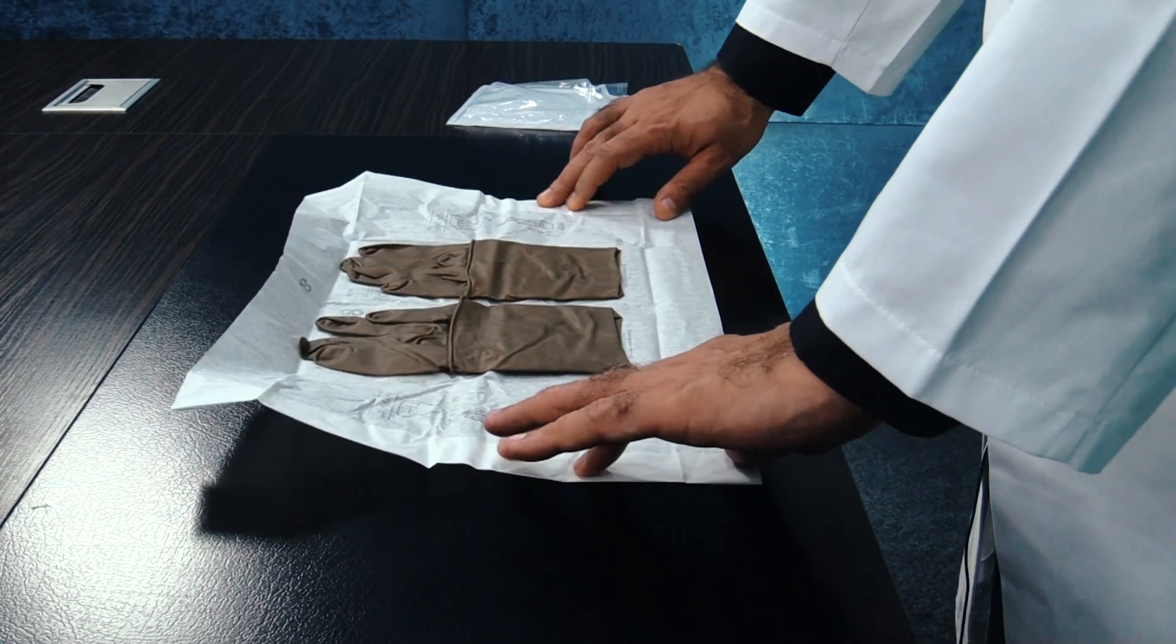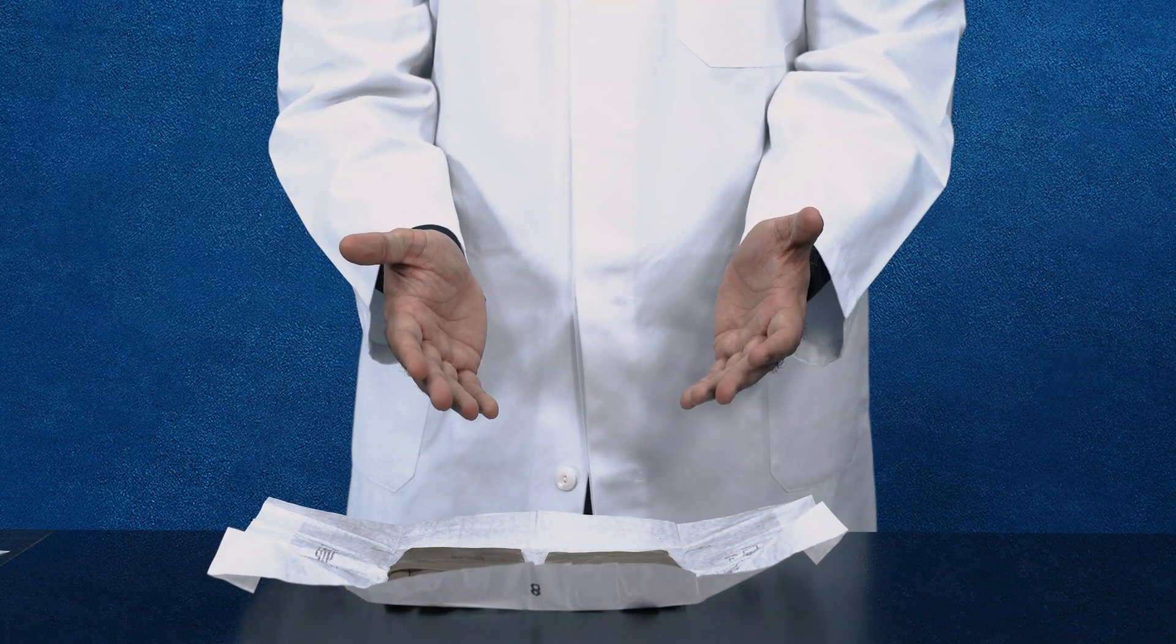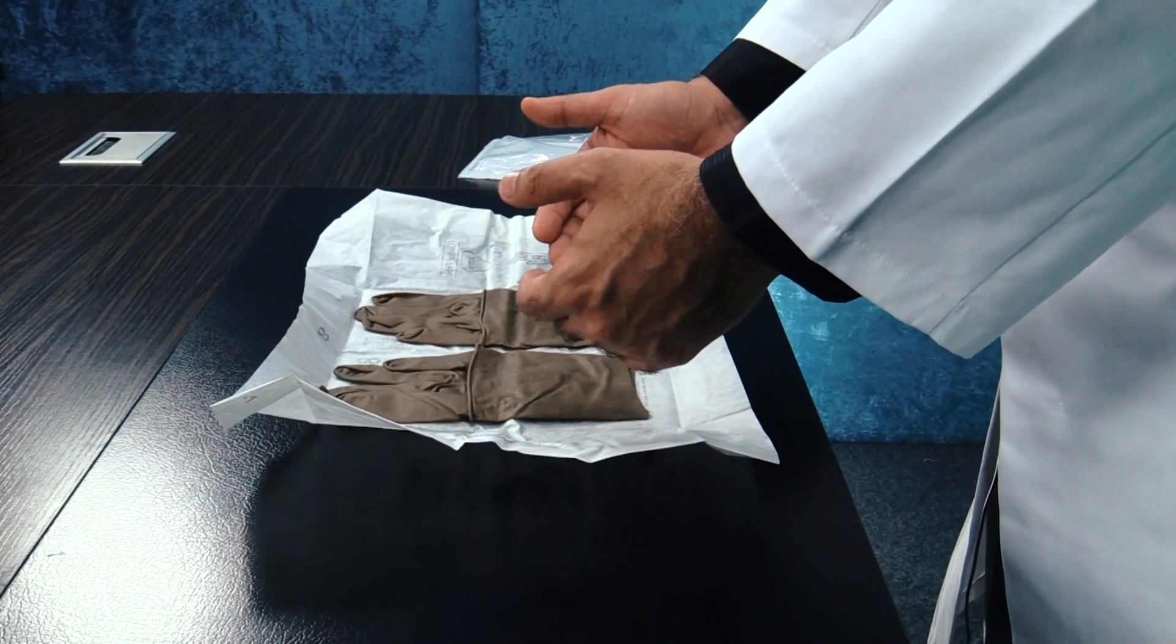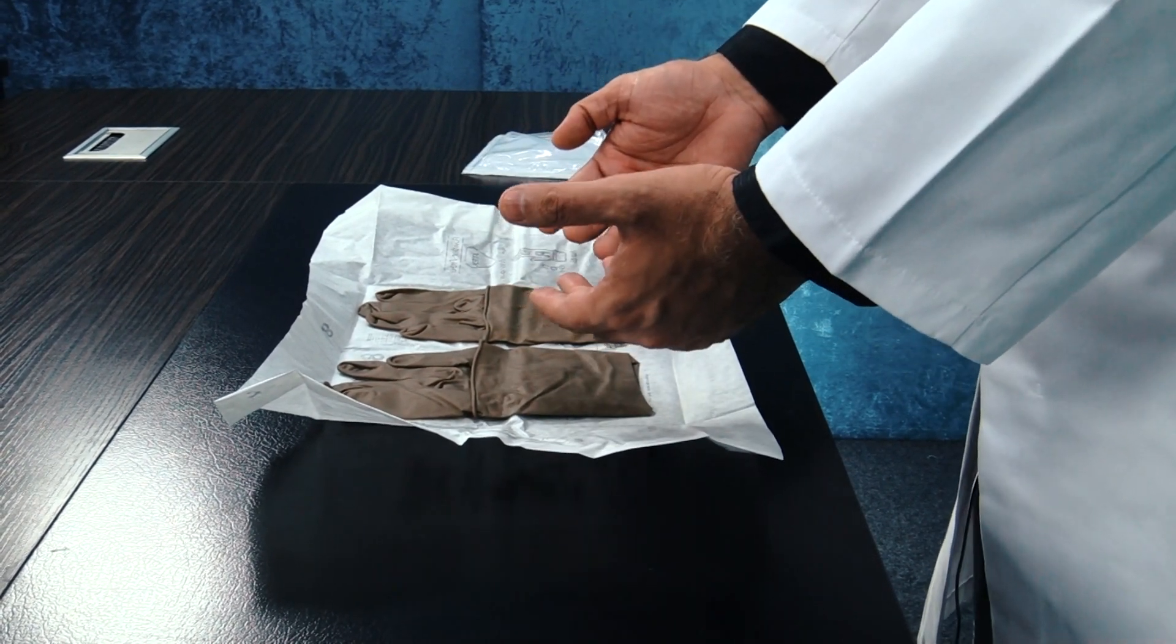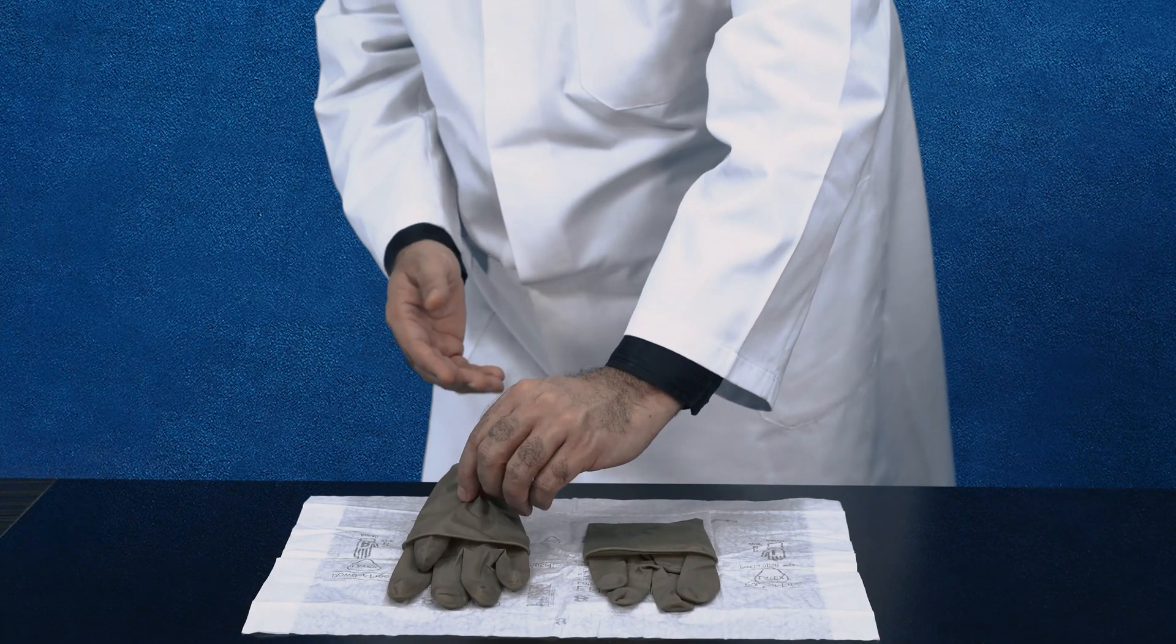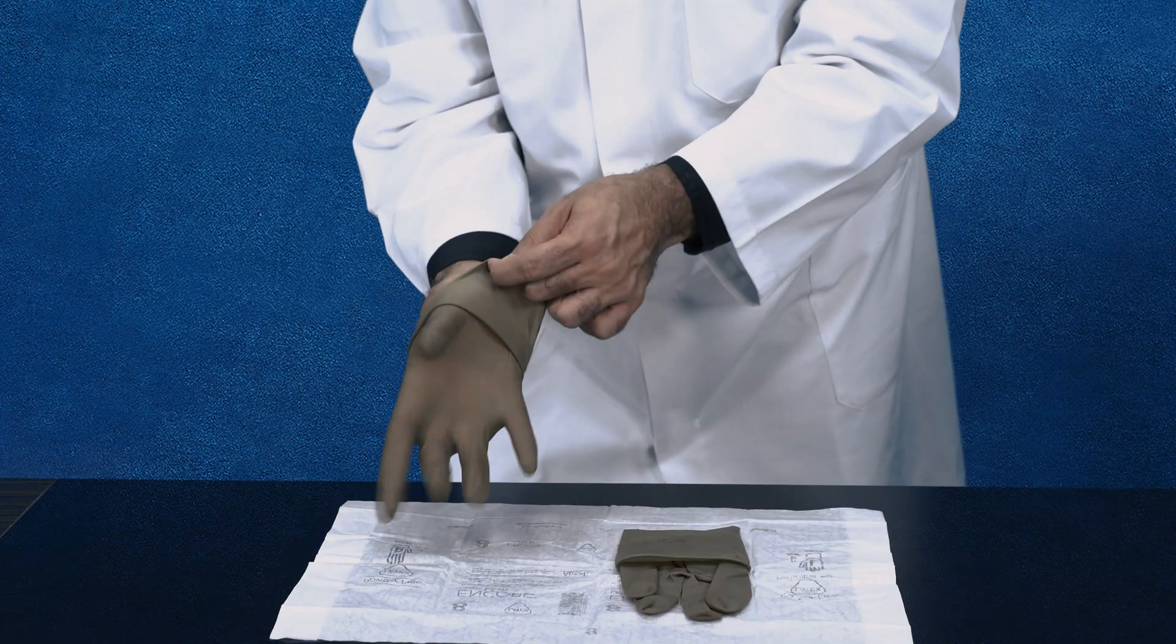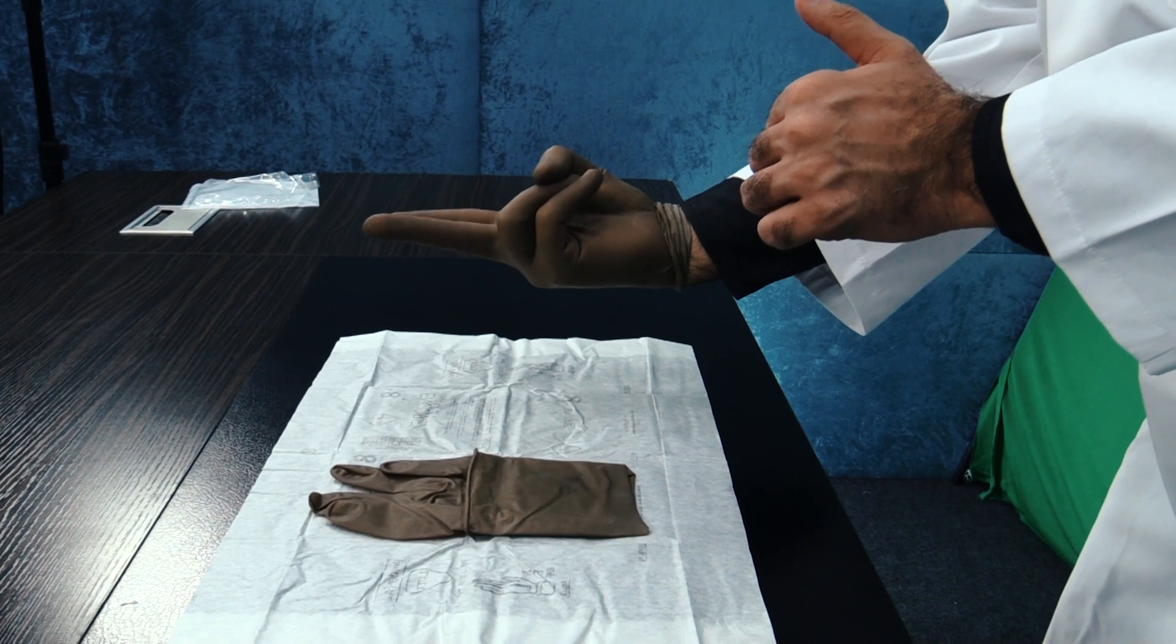I am a right-handed surgeon. I will wear the right hand glove first. The gloves have been rolled onto themselves. This area which you see on the top can be touched, not the other side because that's sterile. You hold the gloves from the inner side, hold it tight, let your fingers go in and your thumb go in, slide inside. So you are done for the right side.